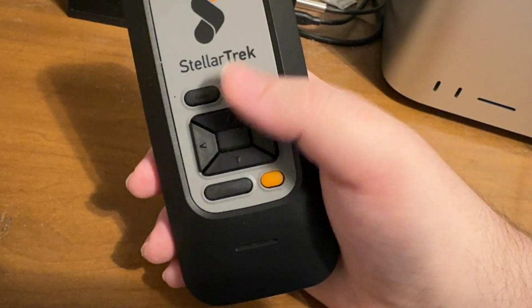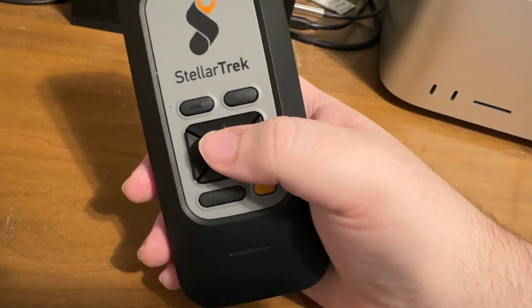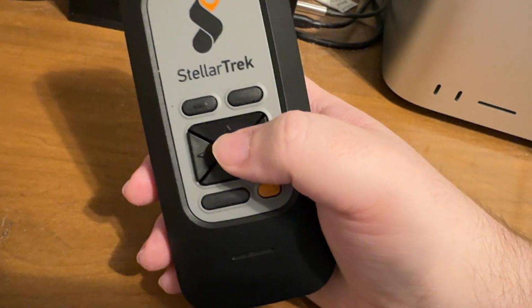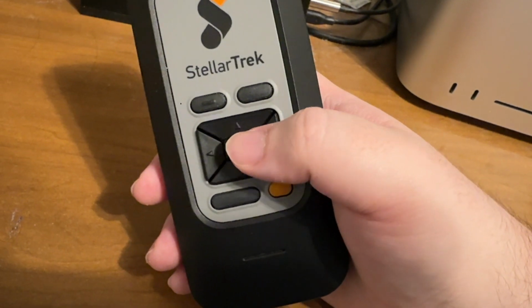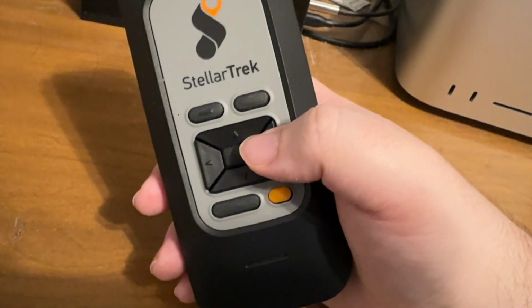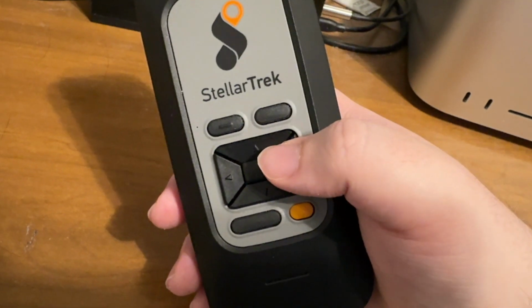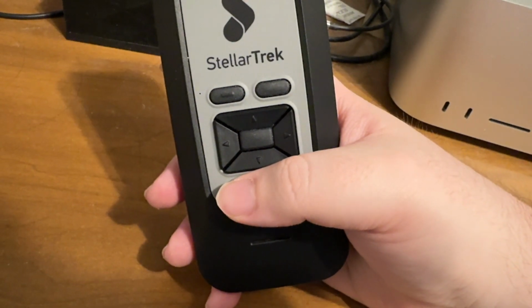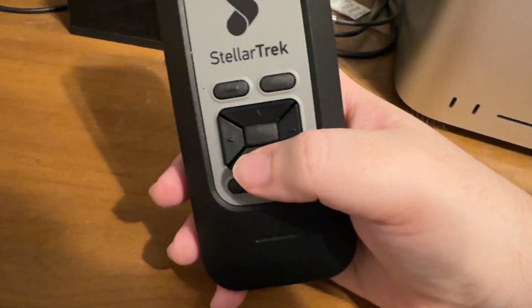So overall, that's an easy process. I do find it maybe a little bit cumbersome personally to move through the keyboard, but it's not too bad. And I think having the Qwerty layout does make it a bit more efficient, at least for me, because I know kind of where I am and where I need to go to find the letters. So that does help. So next, what I want to do is show the options for managing a landmark, which is how this is now saved.